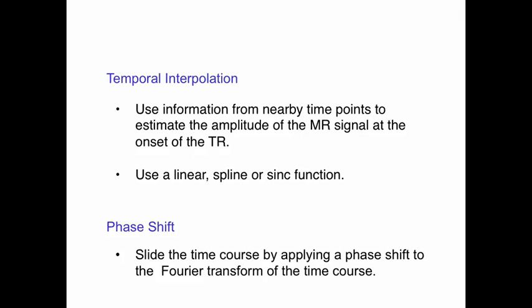So slice time correction, a lot of people don't perform slice time correction. Instead, they incorporate the differences in measurement time in their subsequent models. And so we'll talk about both of these ideas later on when we talk about statistical models.